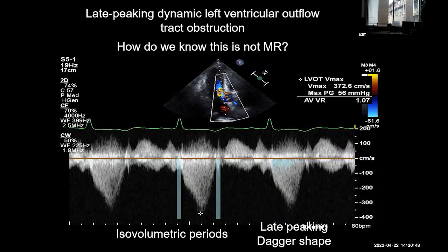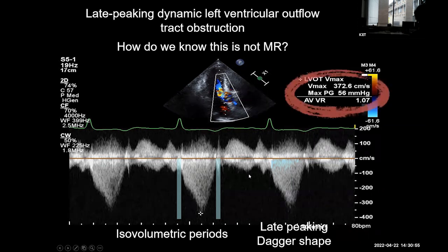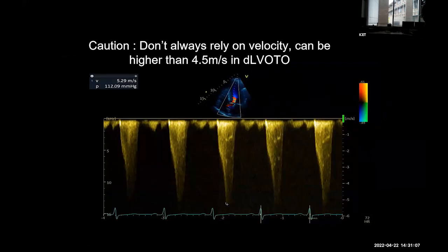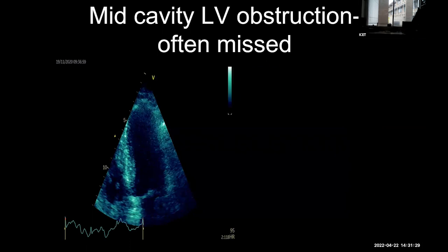In this patient with the hyperdynamic LV, we have: isovolumetric periods not included, the late-peaking dagger shape, and a max velocity that — if it were MR in a hyperdynamic ventricle — should be well into the sixes. Don't rest on one feature alone; look at the whole clinical picture. Also remember that dynamic LVOTO and mid-cavity LVO are different entities with different etiologies, different clinical manifestations, and different Doppler flow profiles.